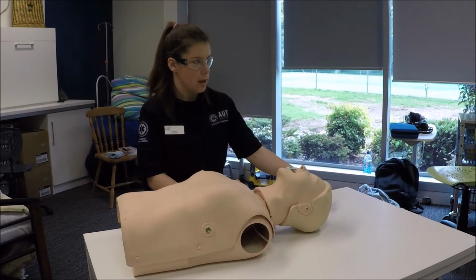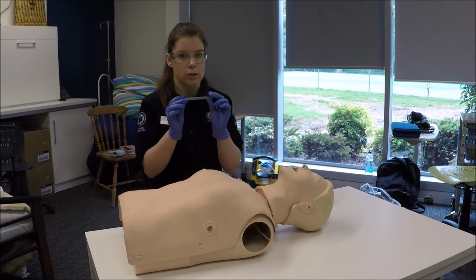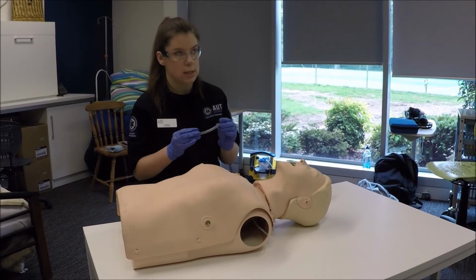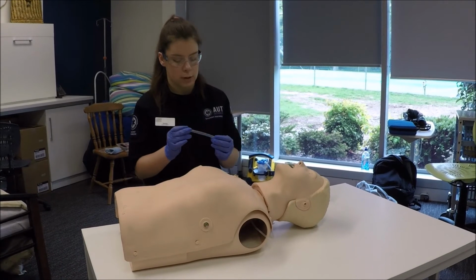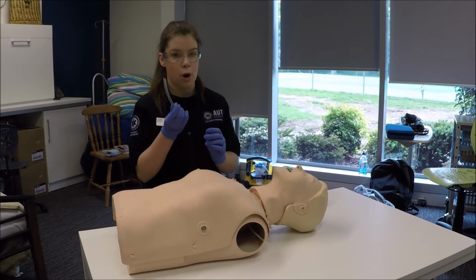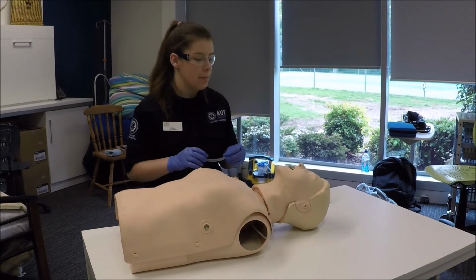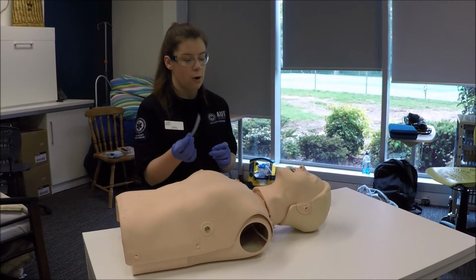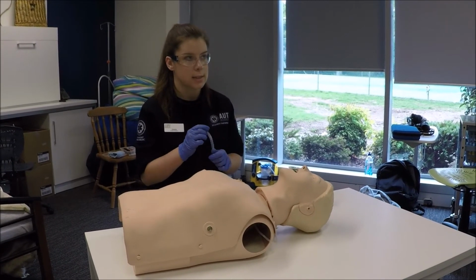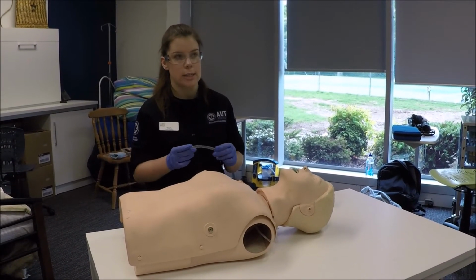Next, I'll be using an NPA, which is a nasopharyngeal airway. Again, this is indicated for a patient with a GCS less than 8 and a verbal response less than 2. Usually, if an OPA is inappropriate, this is used. The benefits of using the NPA over the OPA is that there's less chance of inducing the gag reflex, and it can be used on patients with a higher GCS.